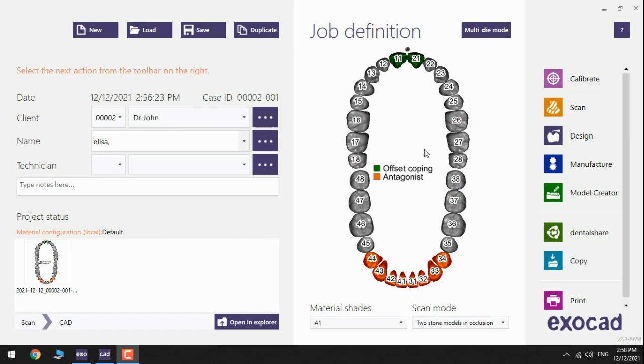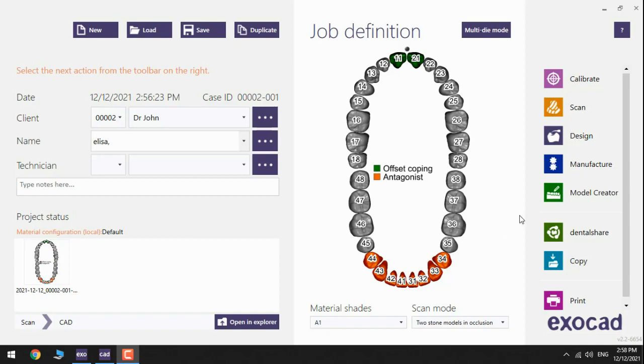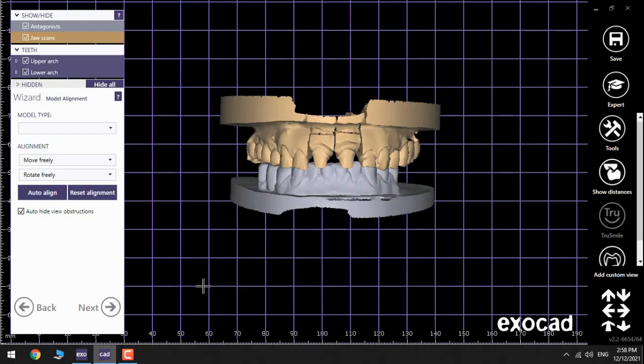The first step is filling up the information in DentalDB on the left side and choose the dies that I need for the upper jaw in this case and also choose the antagonist, and then click Model Creator.